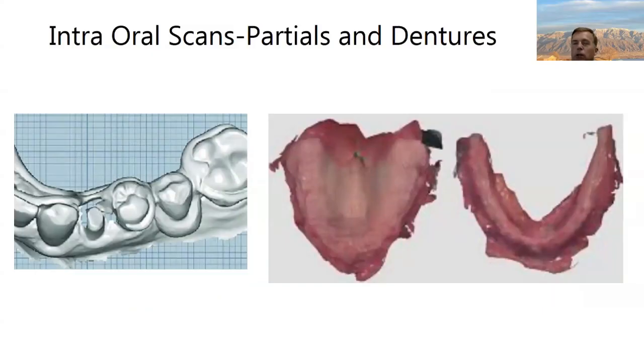If the person wears a partial, like we talked about, take the CBCT scan with it out. And then when you take your IOS scans, again, we're going to be aligning the IOS to the CBCT. So we'll need one IOS with the partial out for alignment, and then we need one with the partial in so that we can build the occlusion. I would recommend taking the photos and the bite scan with the partial in for your partial wearing patients.